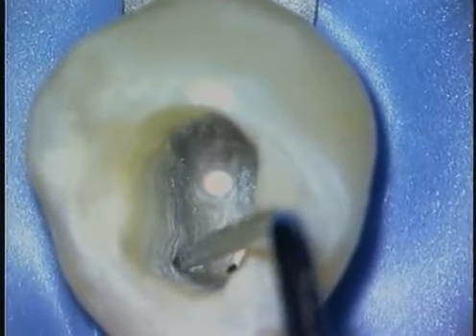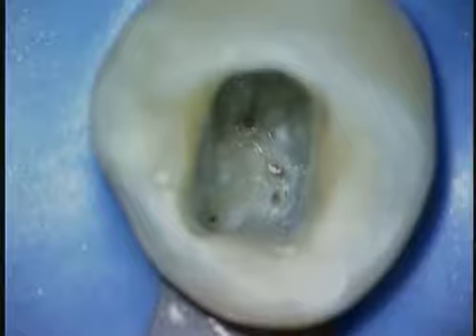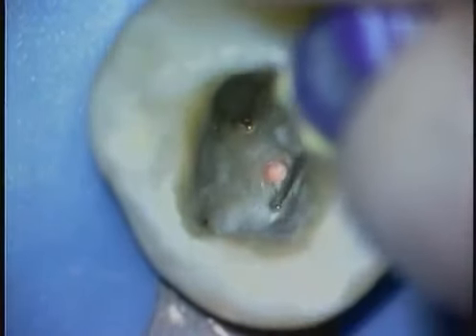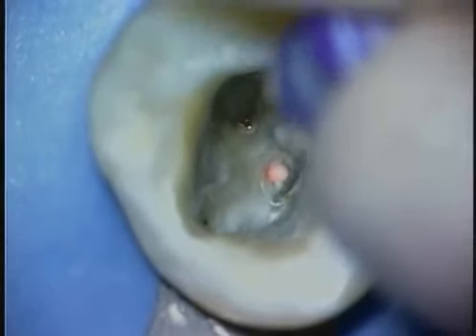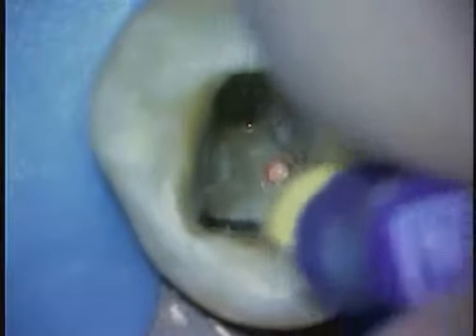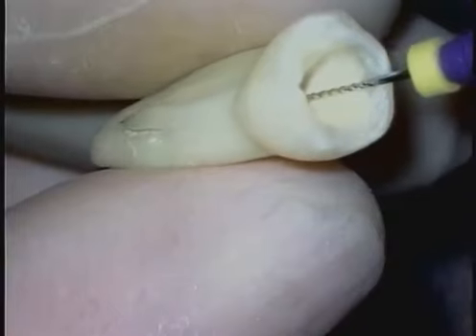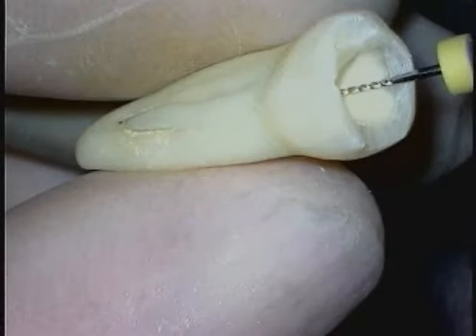The clinician has permission to move access cavities closer to the cavo surfaces if, in fact, multiple preoperative radiographs suggest an aberrant root form. This little orifice or system may be contiguous with the previously packed canal, or it may represent another entire canal, whereas this more mesial lingual system suggests it's a separate independent root. If we observe the tooth in our hand, it's kind of sobering sometimes that we have as much success endodontically as we do. This emphasizes the importance of multiple preoperative views.